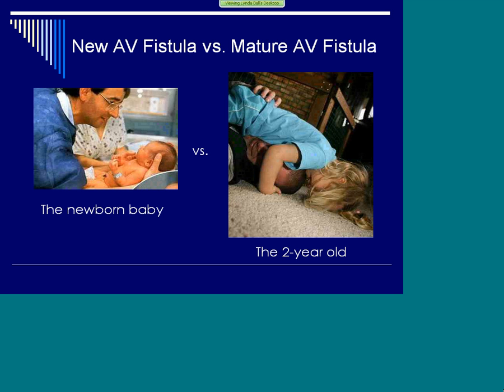So let's talk a minute about the new fistula versus the mature fistula. Are they different, and do we really need to have the expert people dealing with brand new fistulas? And the answer to that is absolutely we do. We need to have some criteria in facilities that identify expert cannulators, not necessarily people who've been in dialysis the longest, because that does not add to your expertise or your clinical skill set.